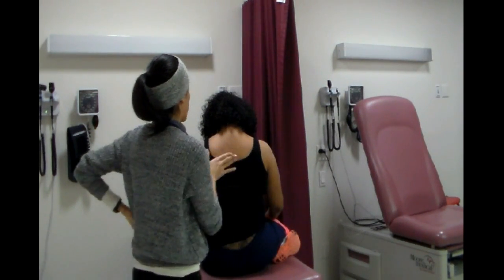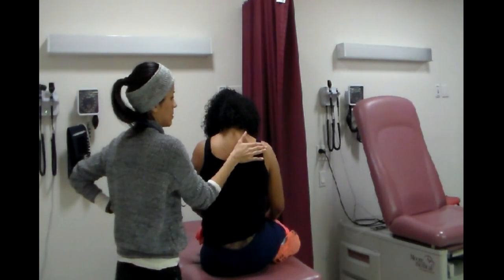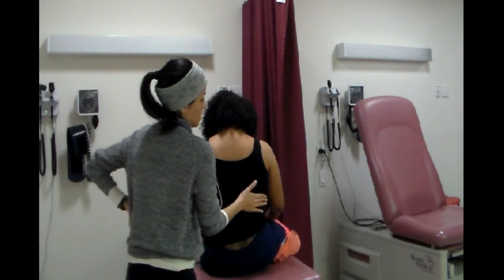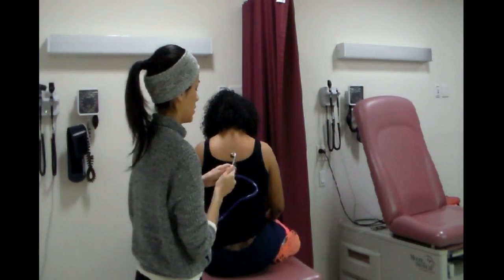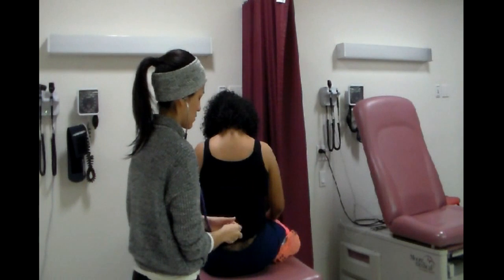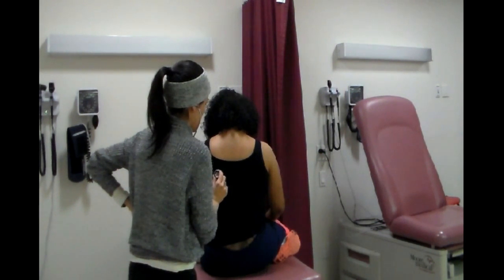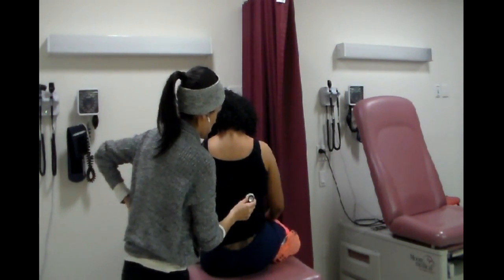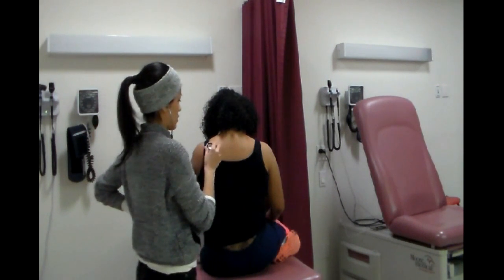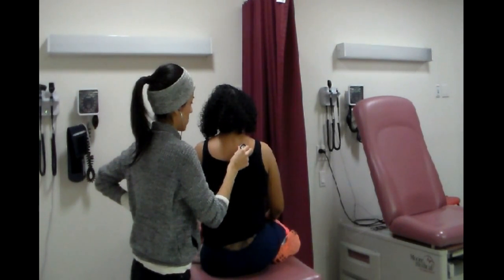Actually, before I listen, I'm going to put my hand here and I want you to say 99 every time I switch hands, okay? Go ahead. 99, 99, 99. And this is for tactile fremitus. Okay, and then I'm going to do the same thing with my stethoscope. When I switch places, you're going to say 99, okay? 99, 99, 99. Okay. And then I'm just going to listen now, so I want you to take a deep breath through your mouth and out of your mouth every time I switch positions, okay? Take a deep breath, okay?